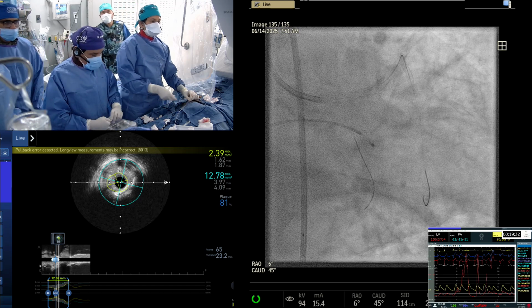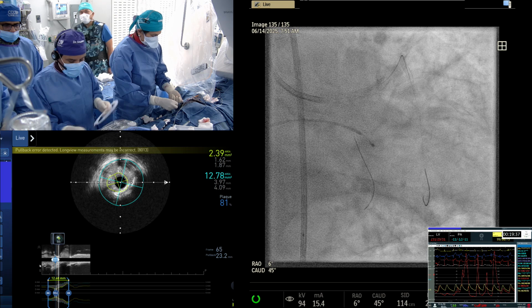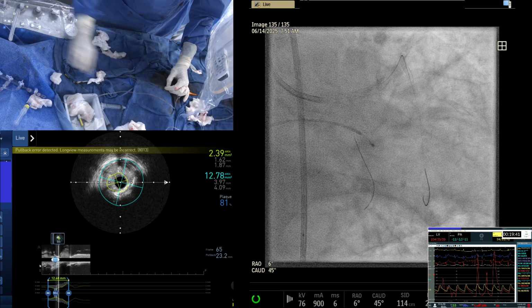You want a picture or leave it alone? No, let's leave it as just proximally dilate, and then we take the picture, and then we do IVUS, and hopefully we are reaching our time. Full 1 hour, so no lecture.